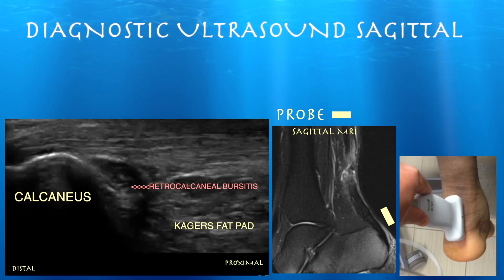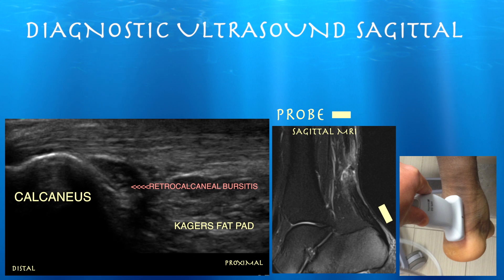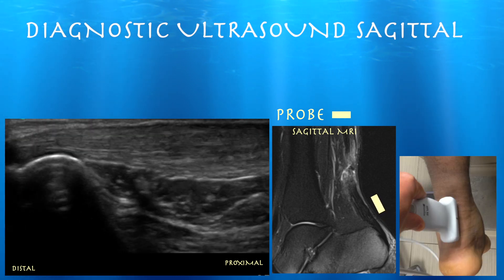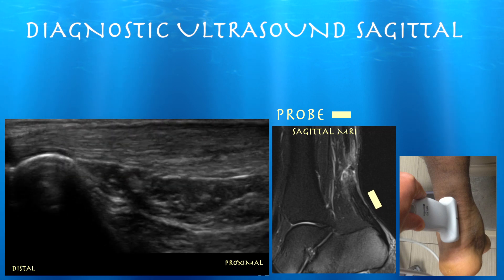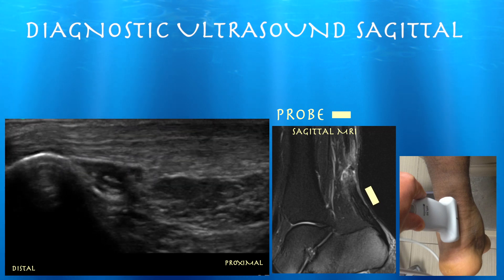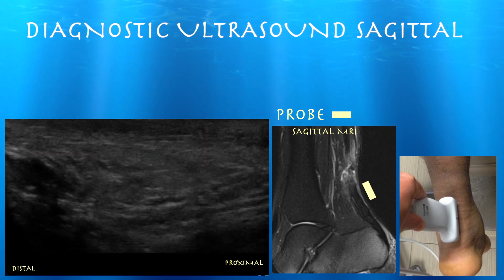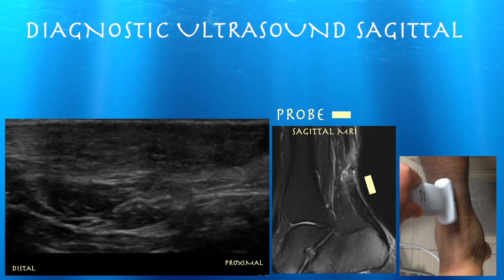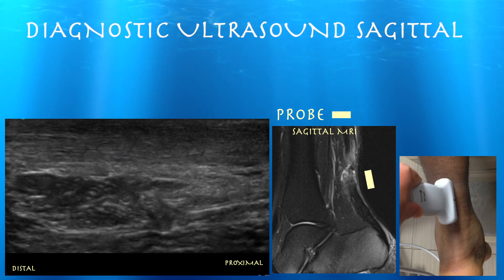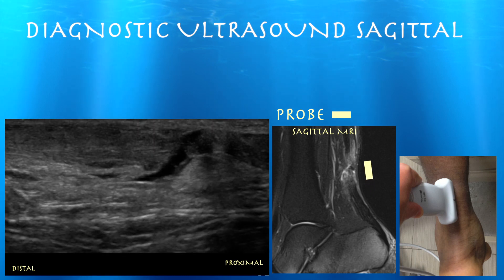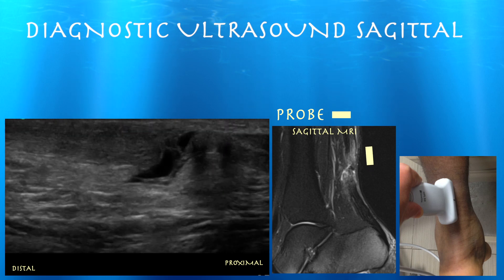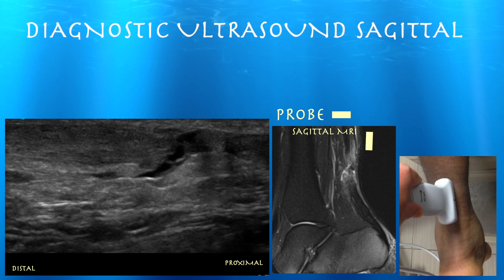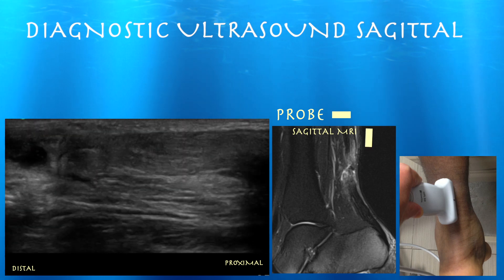On ultrasound, sagittal view, shows retrocalcaneal bursitis. The distal Achilles tendon is fairly well preserved. You can see the probe in the middle picture — the probe is going up approximately along the Achilles tendon. As we approach the tear, you'll be able to see clearly a discrete break within the Achilles tendon consistent with a full thickness tear. Interestingly, this is only a gap of a couple of millimeters, perhaps three or four millimeters. When we actively plantar flex him, we can reduce that gap to about one millimeter.